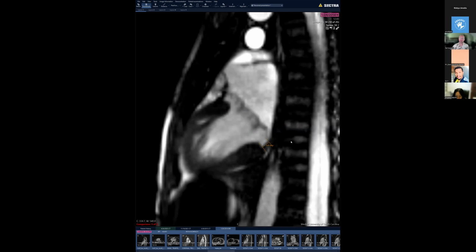Nonetheless, I think all radiologists should be aware of this entity, because there are lots of papers on this, and it's thought to be associated with malignant ventricular arrhythmias. It's interesting that this connective tissue disconnection somehow has an association with very bad ventricular tachycardias and ventricular fibrillation, so sudden cardiac death. So if I see it, and if I'm confident, then I will mention it. If I'm not confident, then I will mention that this may represent mitral annular disjunction, and then the cardiologist can do with it what they want, which would mean either a transesophageal echo and a closer observation, and they can decide for themselves.